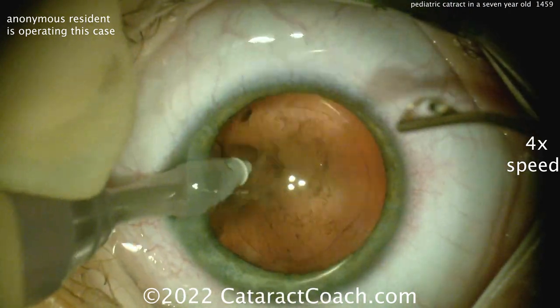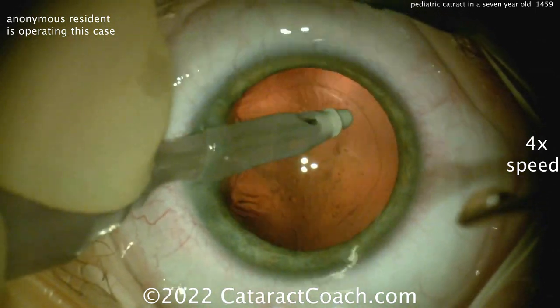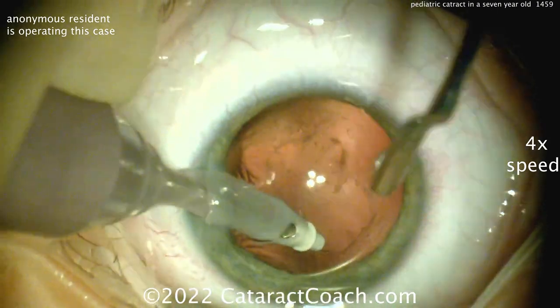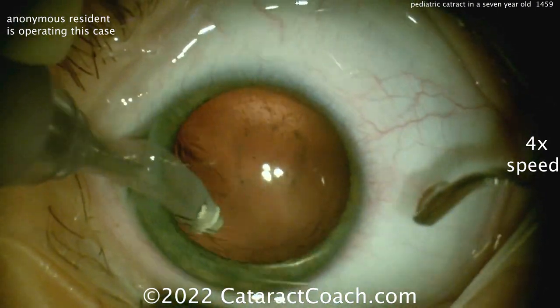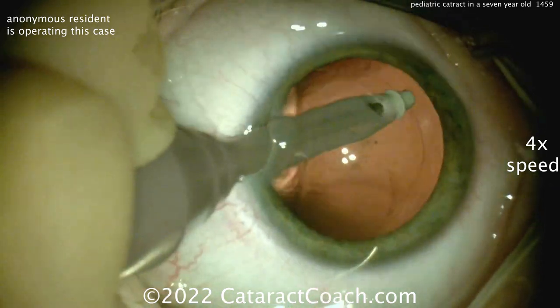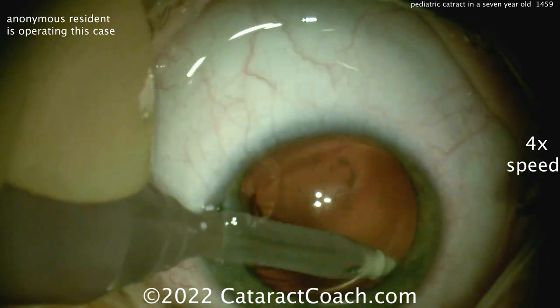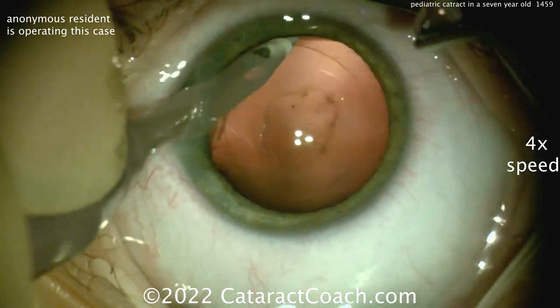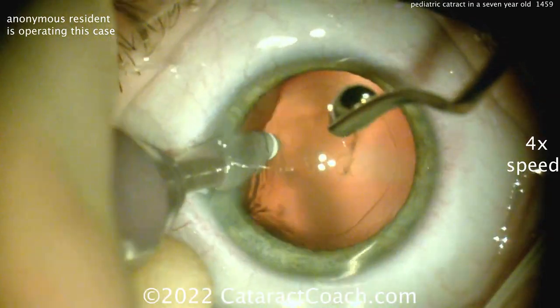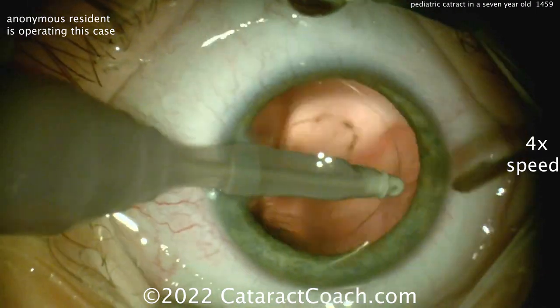Now time to clean up the posterior capsule. Vacuum it as much as you can. The question is: do you do a primary posterior capsulorhexis in a seven-year-old child? I think it depends. Most seven-year-old kids will be able to cooperate for a YAG laser capsulotomy, so you can just put the lens in the bag and do a YAG laser capsulotomy in the future — or you could do a primary posterior capsulorhexis. You can see there's still some staining and opacities in that posterior capsule that you may not get all out. This is a case where it may be advisable to do that primary posterior capsulorhexis, and for a seven-year-old, you're likely going to have this patient under full general anesthesia.